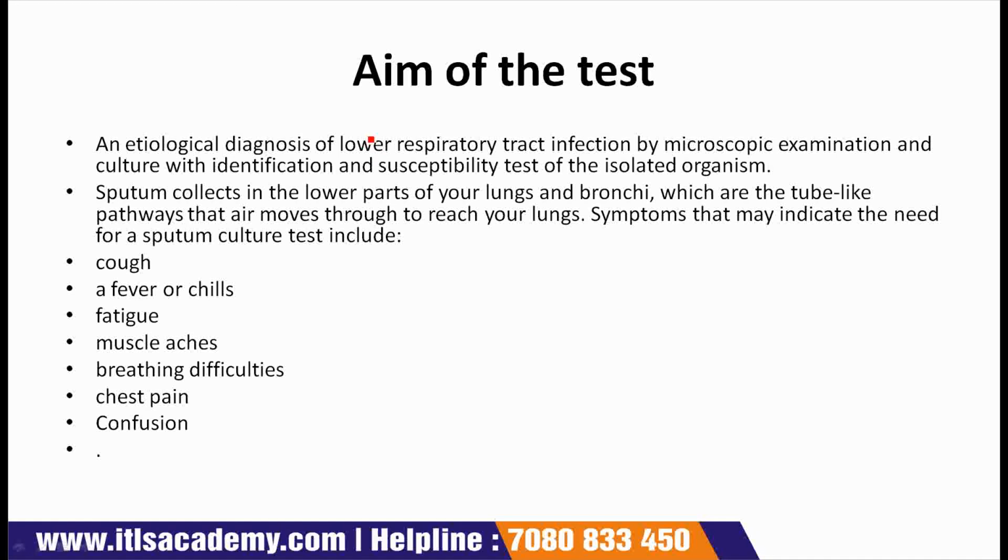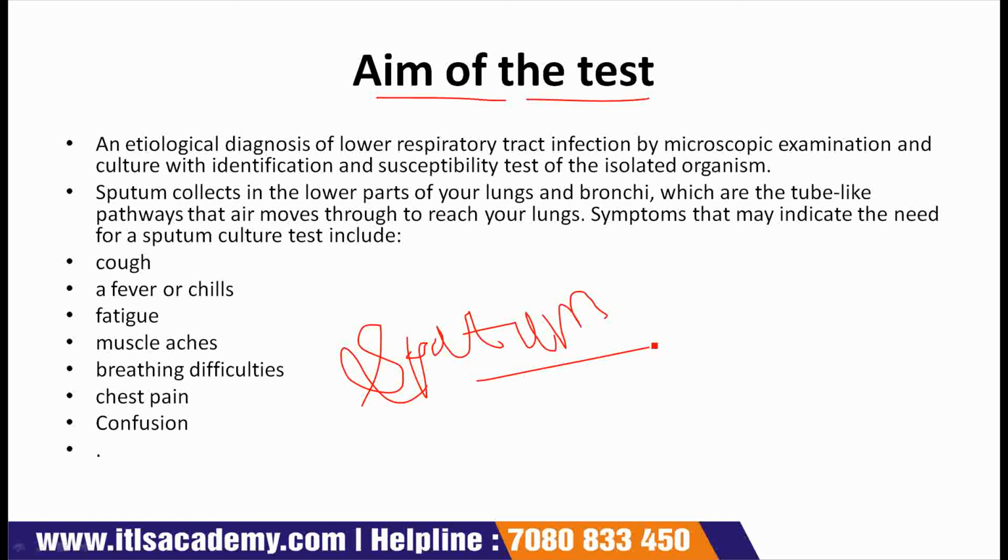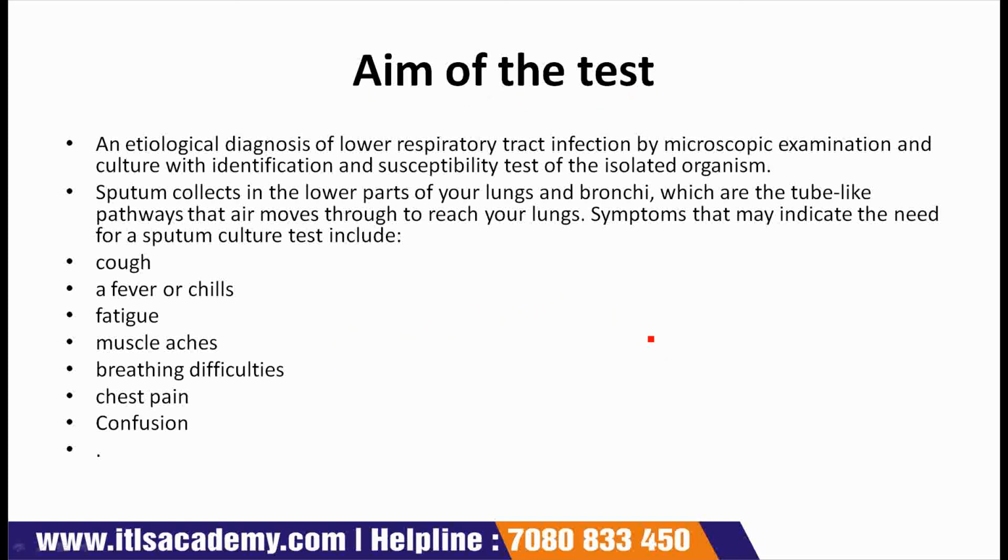Let's see what is the aim of the test, that is our test sputum culture. First point is an etiological diagnosis of lower respiratory tract infection by microscopic examination and culture with identification and susceptibility test of the isolated organism.